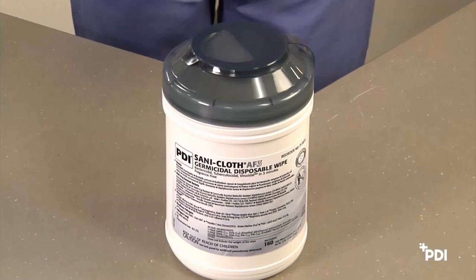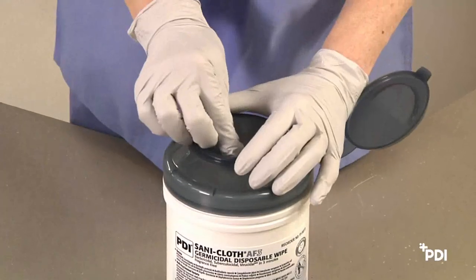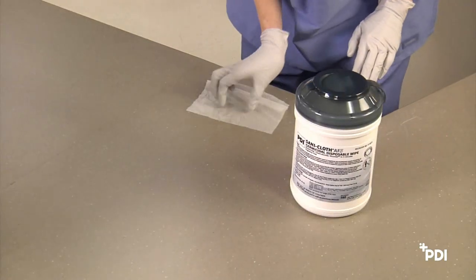Step 2: Dispensing a Wipe. When dispensing a wipe, open the lid and cup one hand covering the opening halfway. With your other hand, remove a single wipe with a uniform pull, out and away from your face and eyes. Close the lid so it snaps shut to prevent moisture loss.